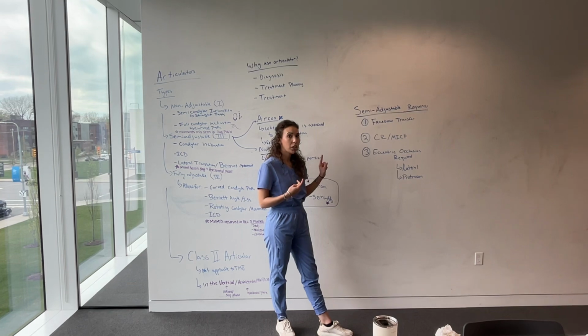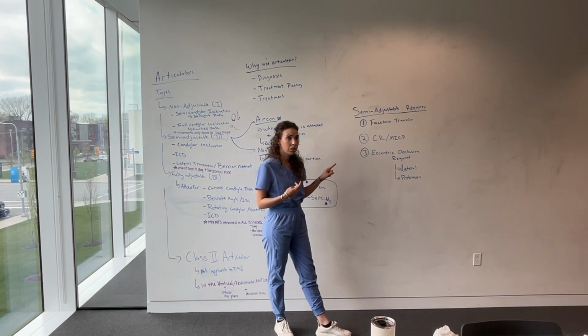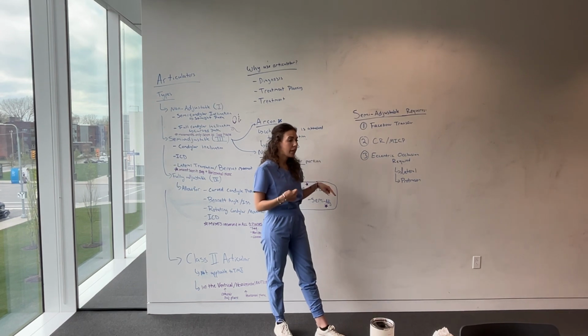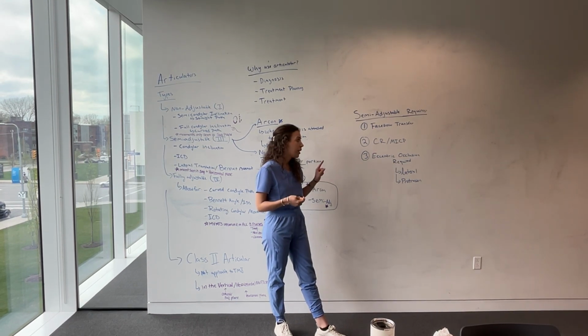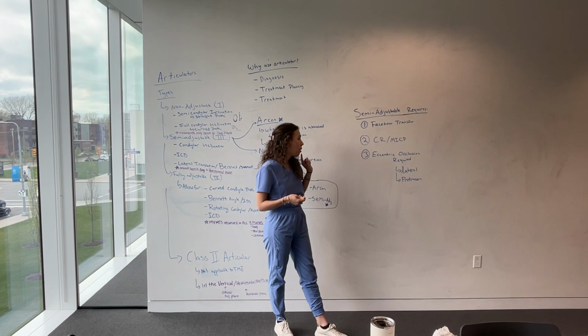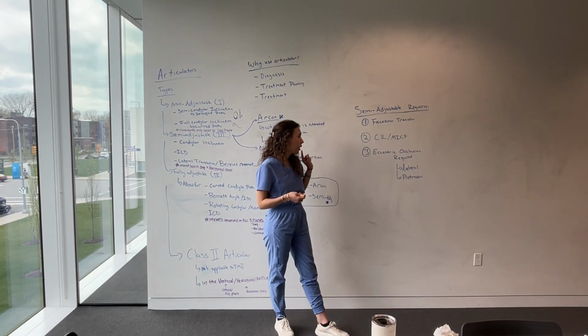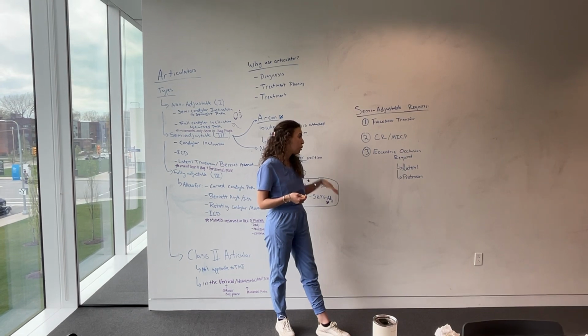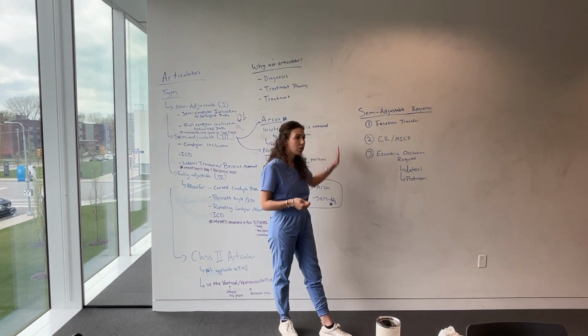Is it measure, or you need to match? You need to determine it basically. Determine it. Like get the proper MICP. Okay, and centric relation if they have. If they have, okay. And then your eccentric occlusion is required for lateral and protrusion. So these are the things.